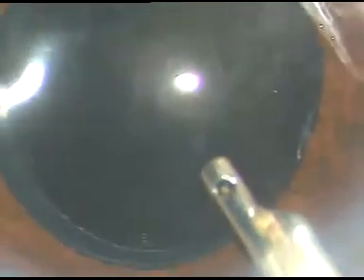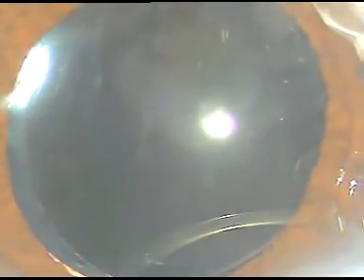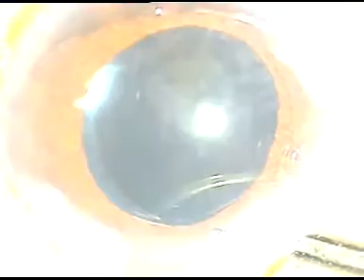I am using Simcoe with BSS. The surgery has been done with Albert David's ringer lactate because the patient is from ICAM, but this last wash, final wash, is being given with BSS so that at the conclusion of surgery the anterior chamber is filled up with balanced salt solution.